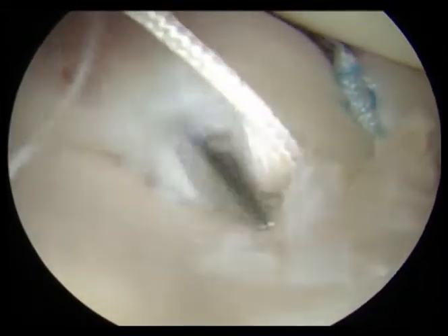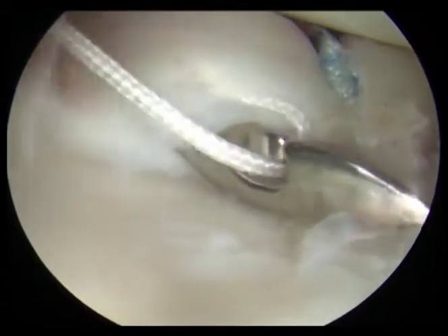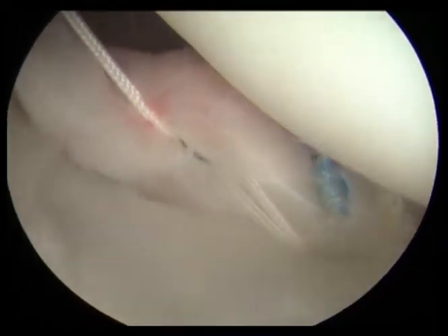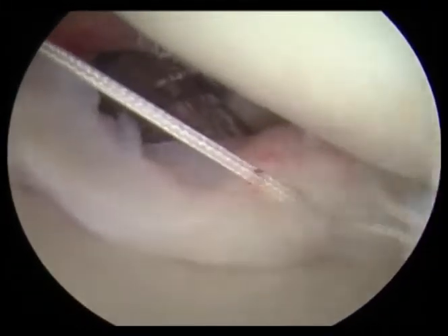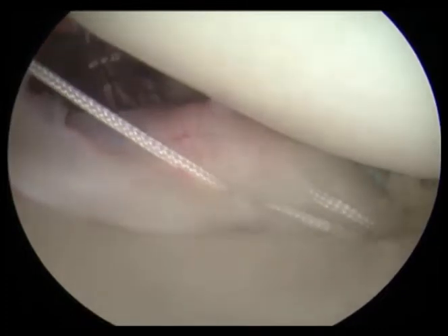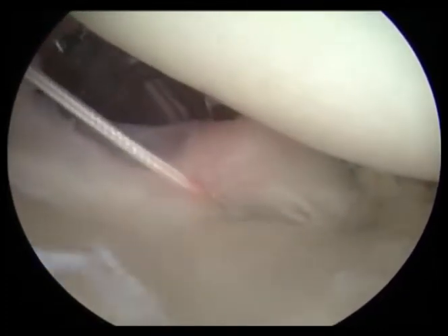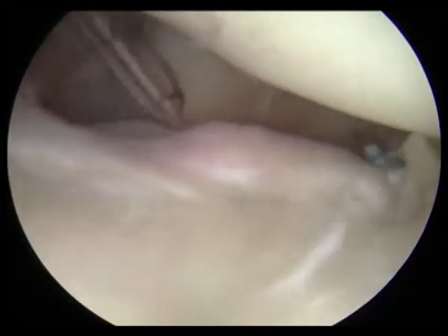Once we've placed our sutures, we're able to use these specialized instruments to perforate the labrum in a very small way and secure it with the sutures. We're able to pass these sutures through small cannulas, then tie the knots and secure the labrum back up to the bone, which provides a normal environment for the ball and socket joint of the shoulder to prevent dislocation.